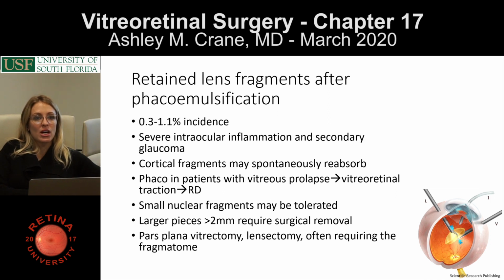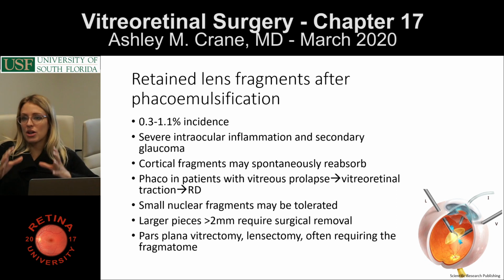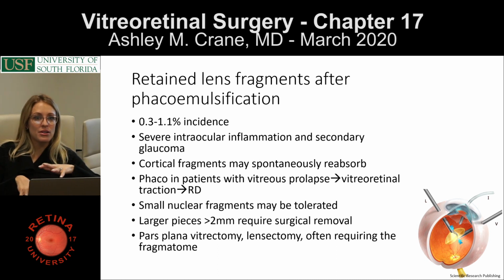Yes. Some people just panic and close up. I think what you have to do is get a good anterior vitrectomy. You try to clean the cortex, and then you try to put a lens either in the sulcus or an ACIOL or whatever you think, and then close the corneal wounds.